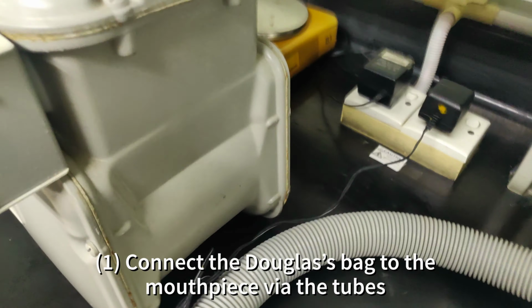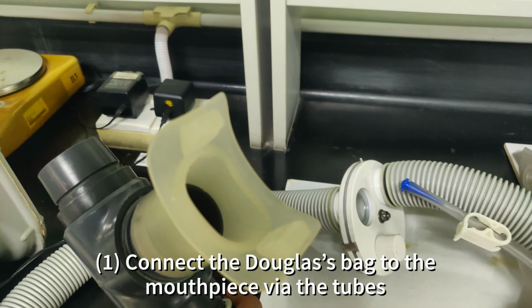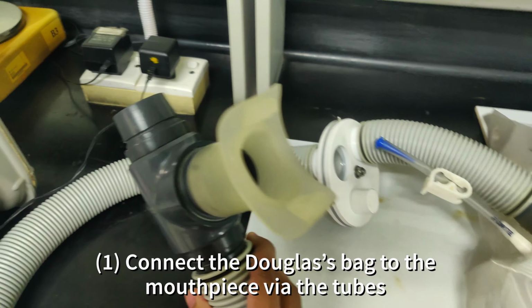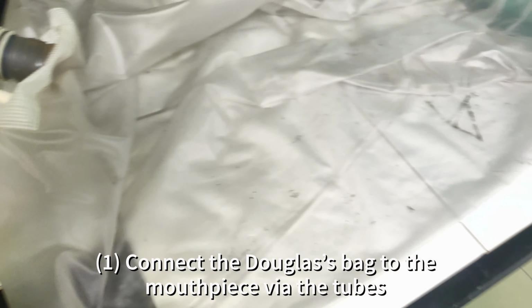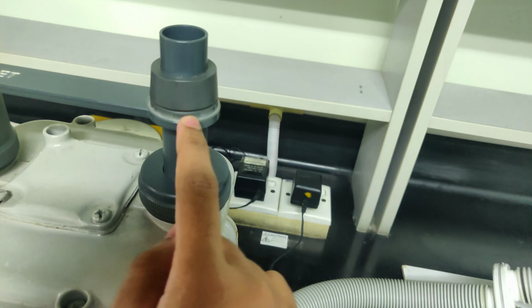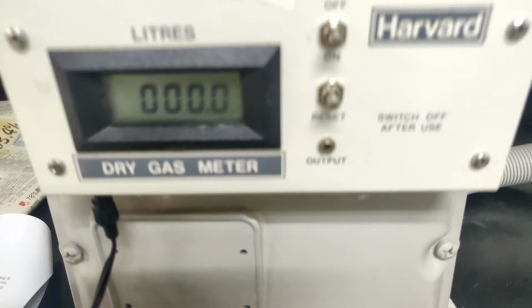As we can see here, we have the tube that is connected directly to the mouthpiece here. The subject needs to perform normal breathing, and all the expired air will be collected directly in the Douglas bag. After you finish the experiment, the air from the Douglas bag will be transferred directly to the gas meter by this inlet. From here we can get the total amount of expired air for the subject.